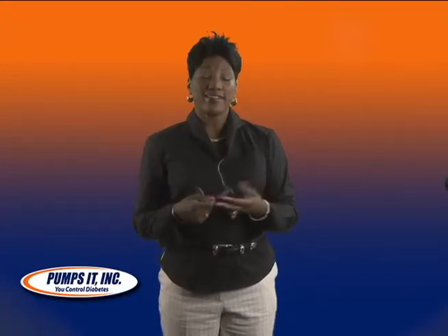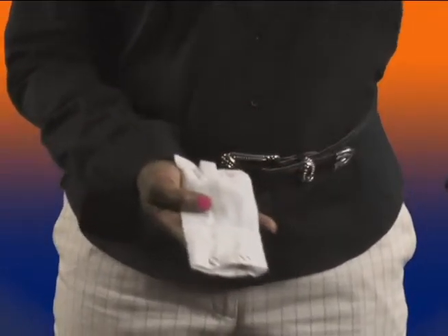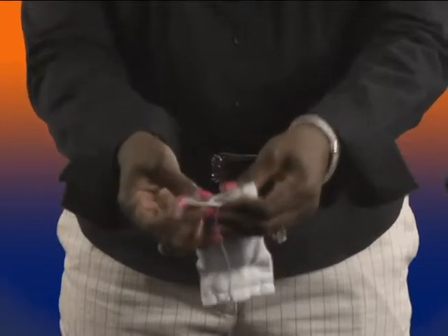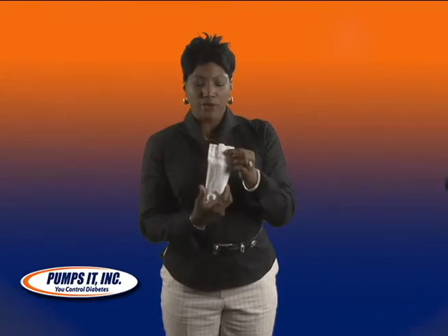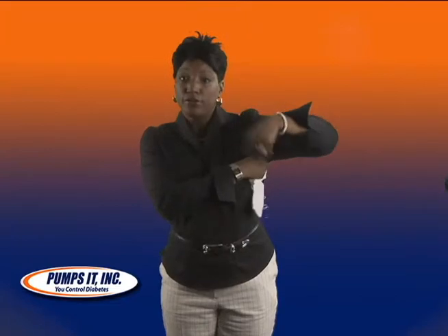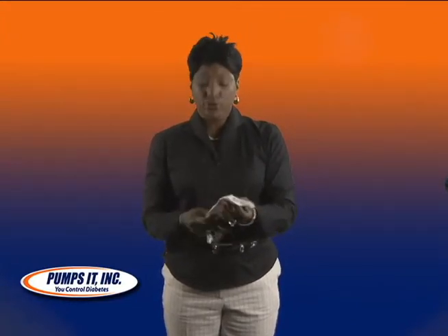For women who are more heavily endowed, we have an accessory called a pouch. Your pump fits down in the pouch snugly. It snaps on the end to secure it in place and there's a clip on the back side of the pouch. You can hang it either in the center of your bra or some ladies prefer to hook it under the arm. This is very inexpensive, and for ladies that are crafty, you could even make one yourself.